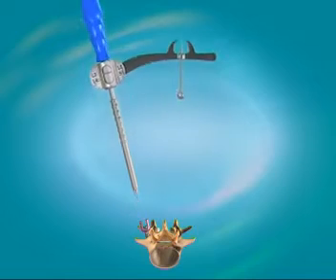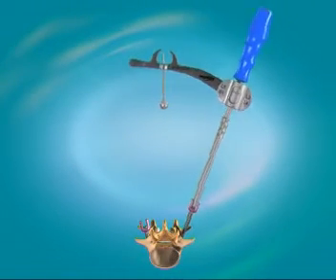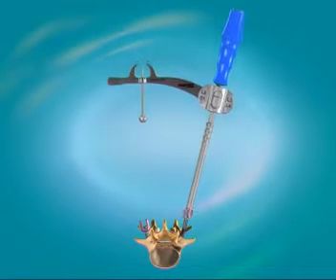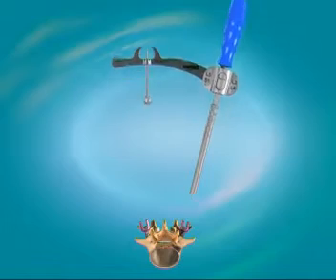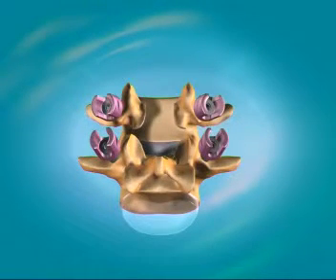The pedicle screw saddle should be positioned such that the TOPS arm will not interfere with the transverse process. This step is repeated for all 4 pedicle screws, paying careful attention to align the screws on the same plane in the lateral fluoroscopic view.